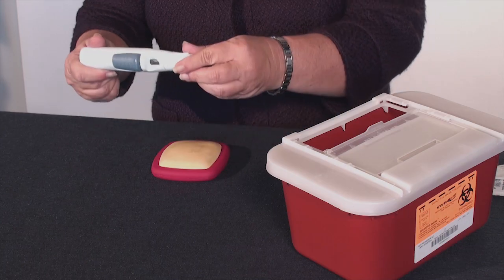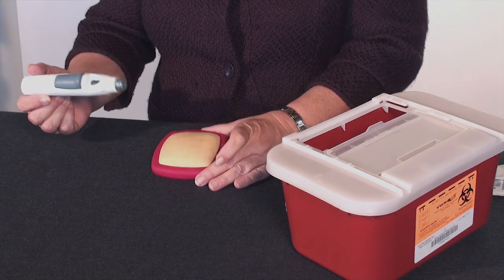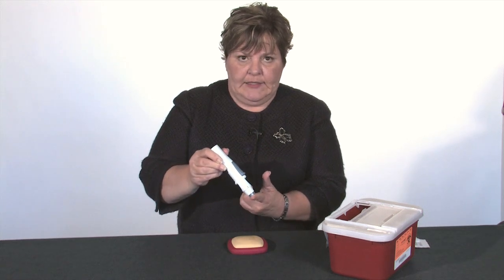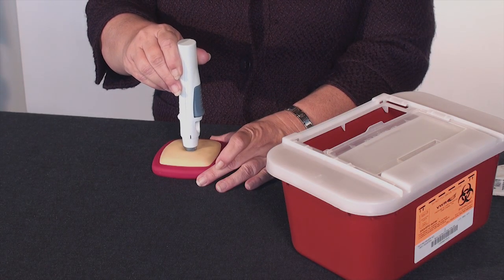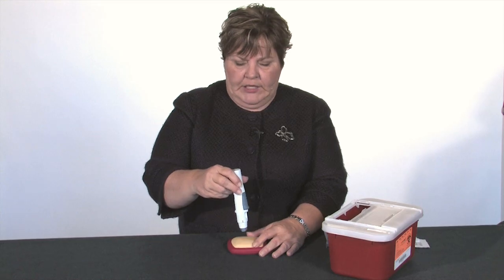To use the Sympony syringe, this just twists off and it's ready to inject. You want to hold the device perpendicular to the skin. This is a little bit springy, so once that is depressed it will allow us to activate the device. You want to make sure that it's even against the skin, not at any kind of an angle. You don't need to pinch the skin — you can if that makes you feel like you have more control, but it's not necessary.